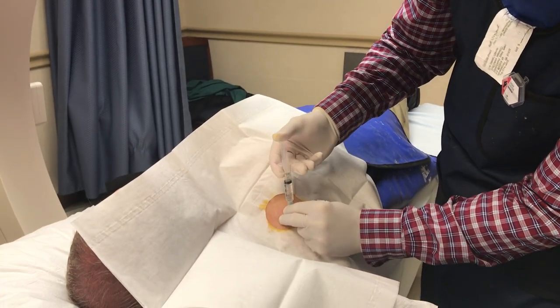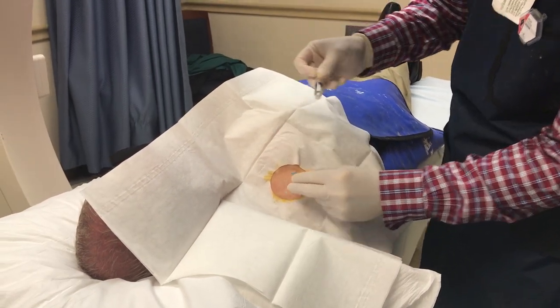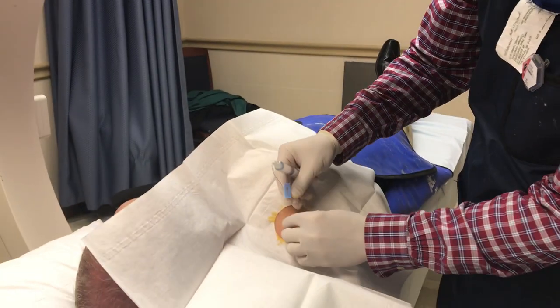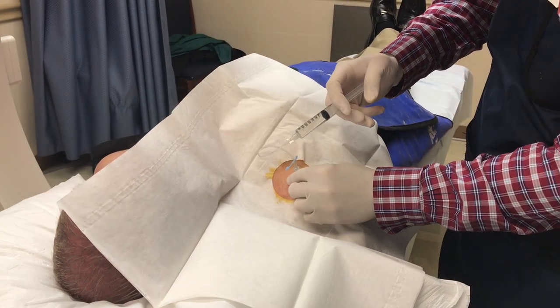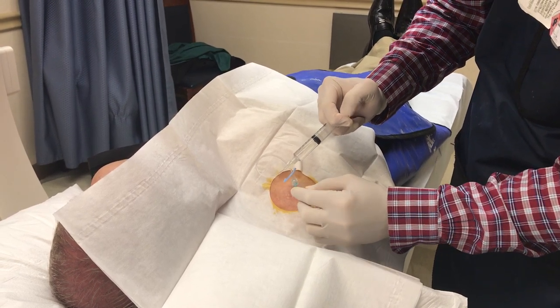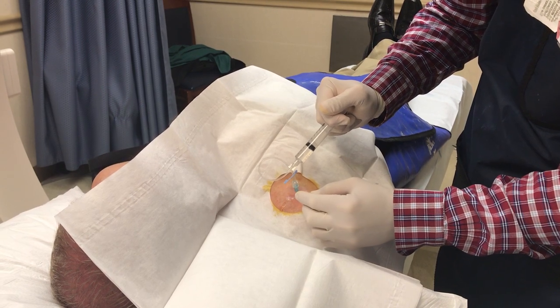As you can see, I'm right above the surface there, and there's no resistance. We'll un-cap the needle and check our needle placement again — X-ray. This is the contrast of saline isovue that we're going to put in the shoulder. I'll feel for my needle placement — a nice, easy flow tells me that I'm inside the joint.